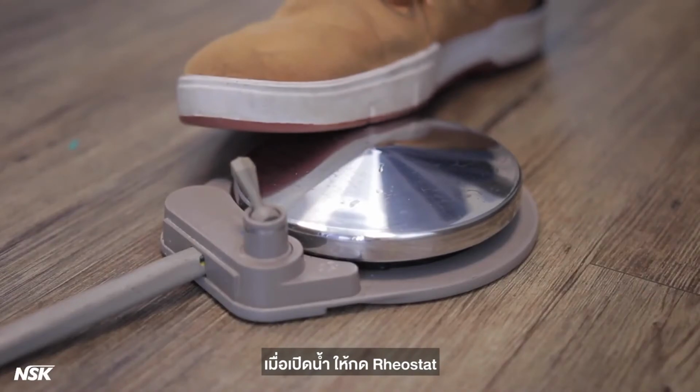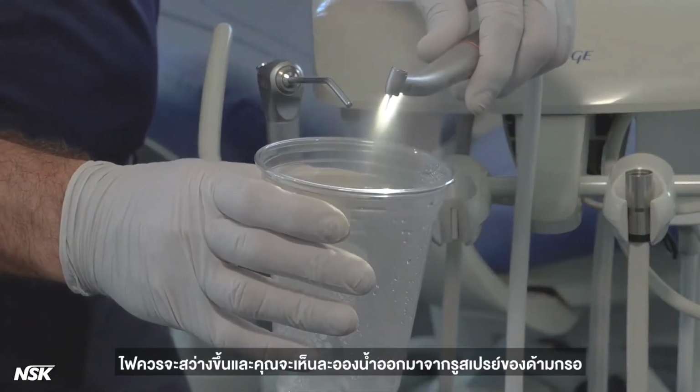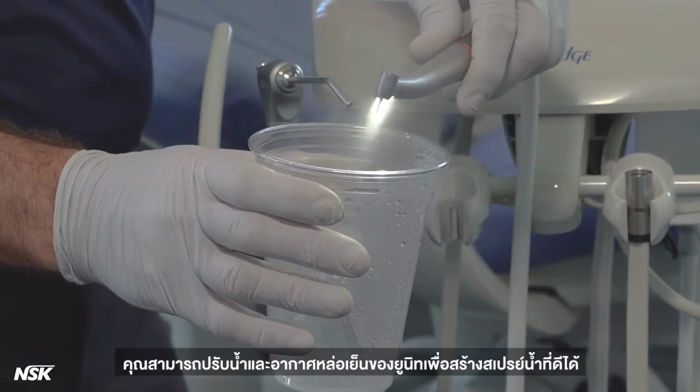With the water on, press the rheostat. The light should come on and you should see a water mist coming out of the spray holes of the attachment. You can make adjustments on water and coolant air of the delivery unit to create a good water spray.